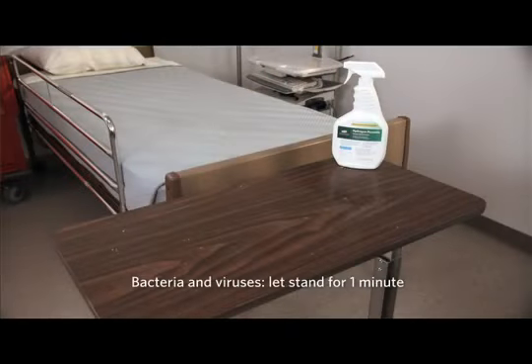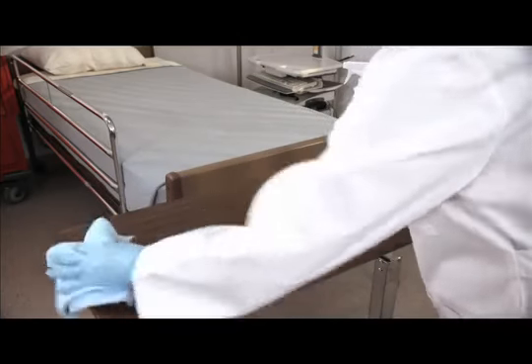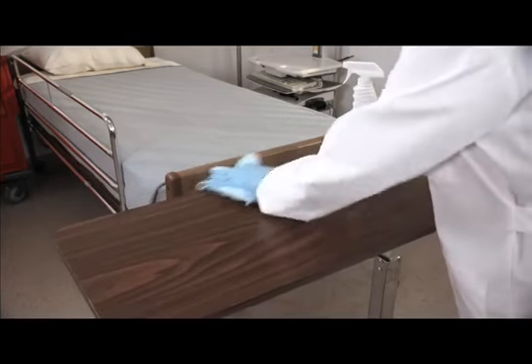To disinfect, let stand for 1 minute for most bacteria and viruses. For TB, let stand for 4 minutes. Then wipe with a clean, damp cloth.